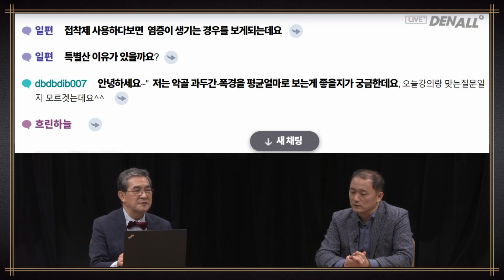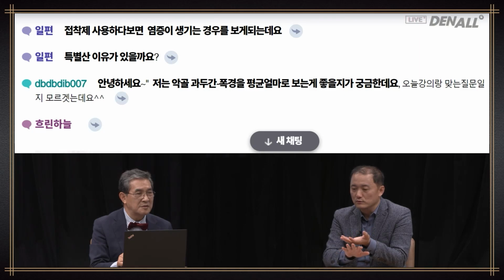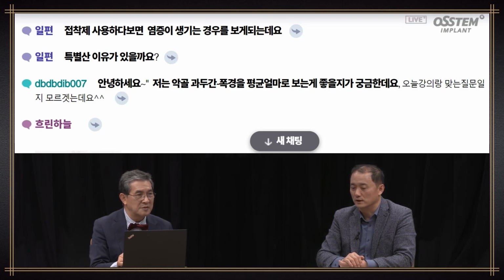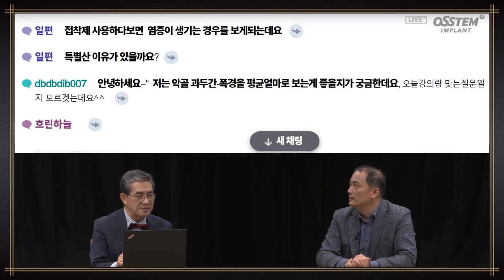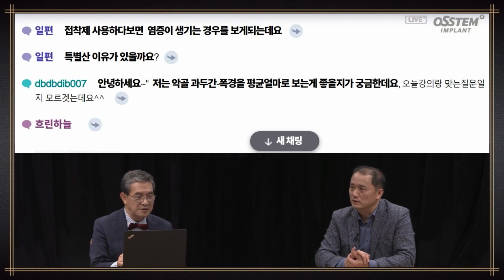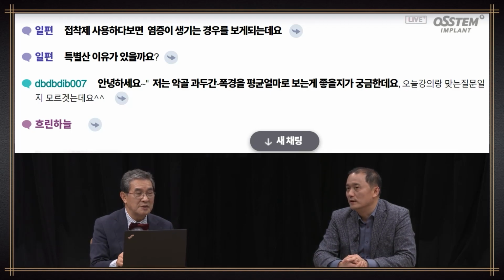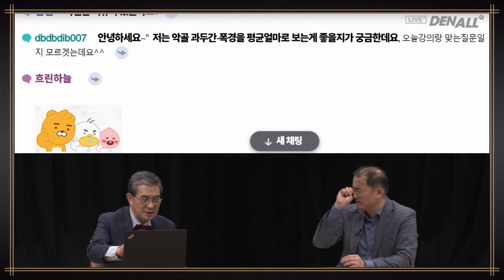Another reason could be, I couldn't find the photo for today's lecture, but five years ago I had a patient who loved the denture adhesive, and the occlusion of the denture, horizontally and vertically, compared to the midline I had in mind, veered away too much. So the denture itself became a stimulus because the tissue changed too much. If there is excessive tissue change and you continue to use it, sometimes you get inflammation because there is too much stimulus. And with resin polishing, you can create a smooth surface, but with adhesive, compared to resin, food can stick, and maybe that contributes to inflammation.